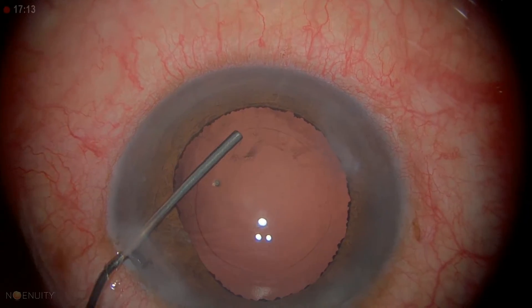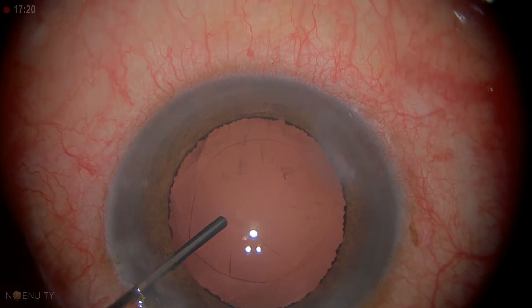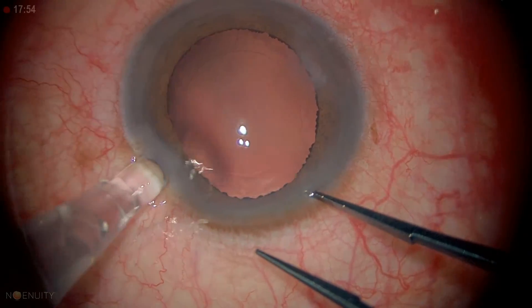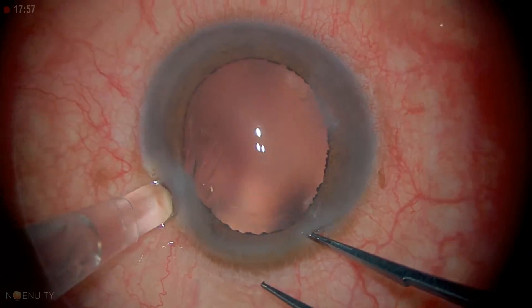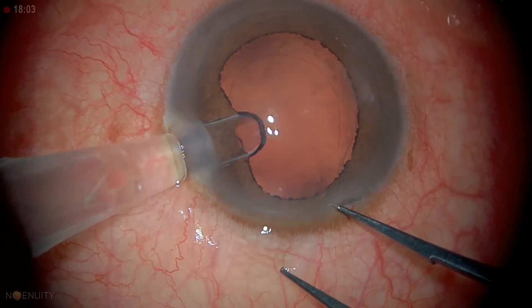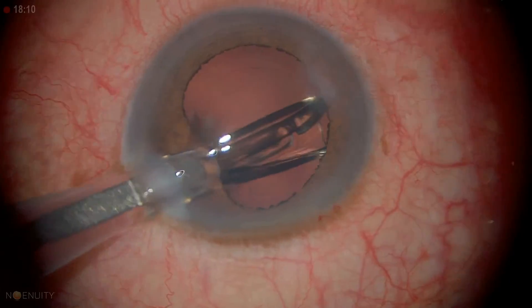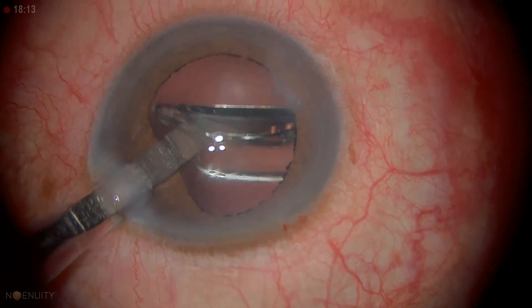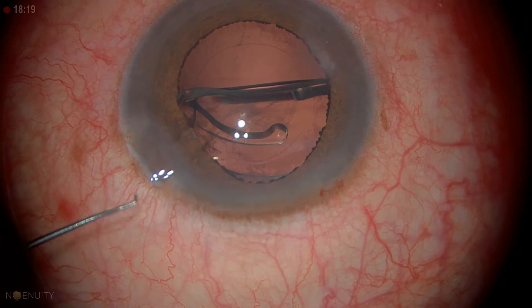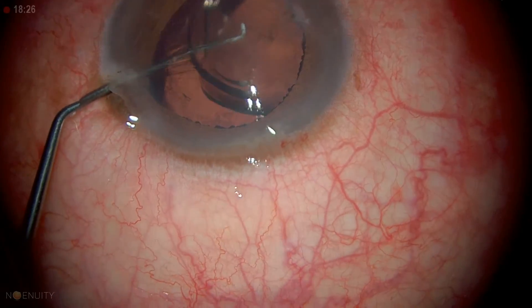We're going to inflate the capsular bag. When we have a little iris prolapse, we don't want to over-inflate, but we want to get under the capsule. Sometimes we remove the cells on the back of the anterior capsule. From a clinical and scientific standpoint, I don't know that it's been shown to make a difference in any studies. I do it in cases of pseudoexfoliation, retinitis pigmentosa, uveitis — cases where patients are at risk for anterior capsular phimosis. In general, I don't think it makes a difference.